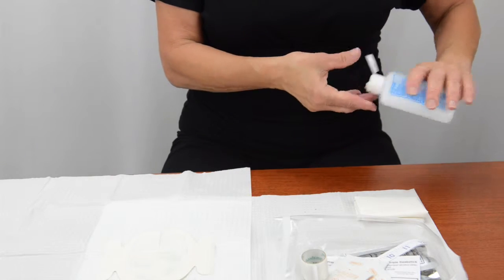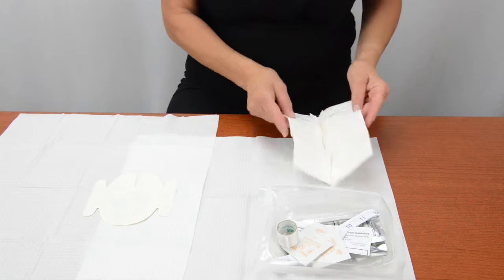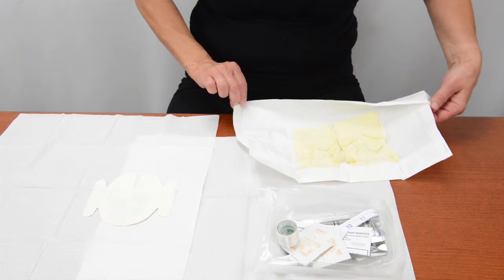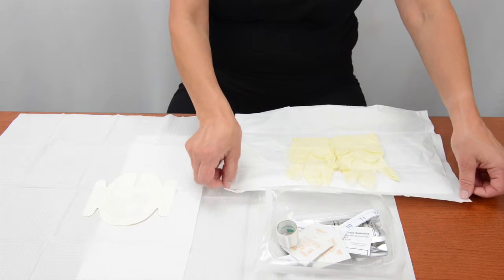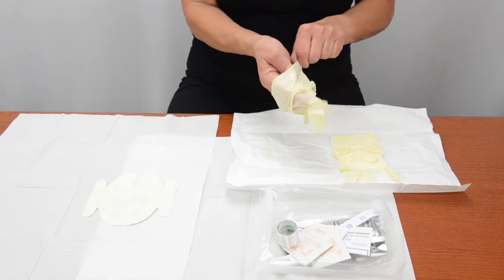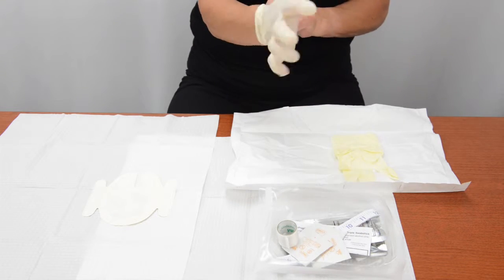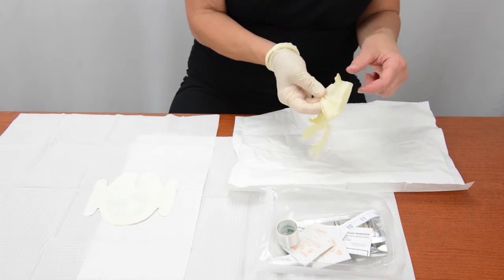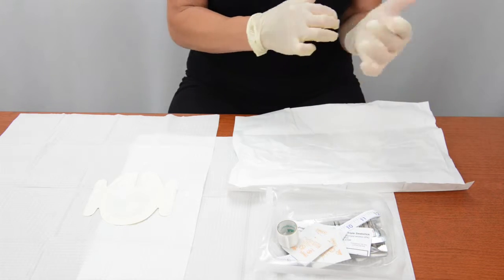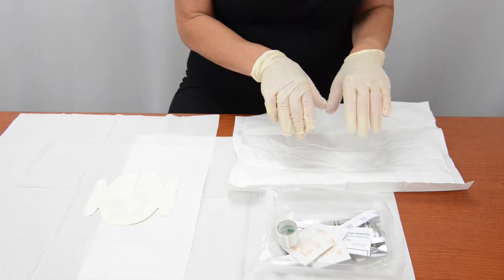Remove your non-sterile gloves and put them into the trash. Clean your hands with soap and water or with an alcohol-based hand gel. Open the sterile glove packet on the safe zone, handling only the edges of the packet. Do not touch the inside of the packet or the gloves with your fingers. Carefully pick up one of the sterile gloves by the rolled cuff and slide your other hand into the glove, making sure not to touch the outside of the glove with your bare fingers. Pick up the other glove by sliding the fingers of your sterile gloved hand under the rolled cuff and slide your other hand inside the glove. Do not touch anything that is not sterile once you have put on sterile gloves.